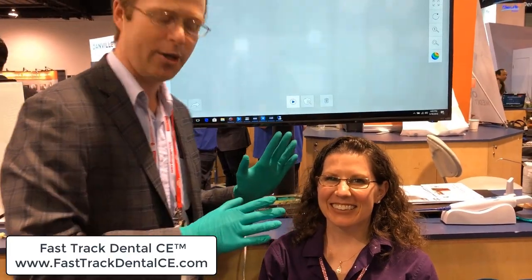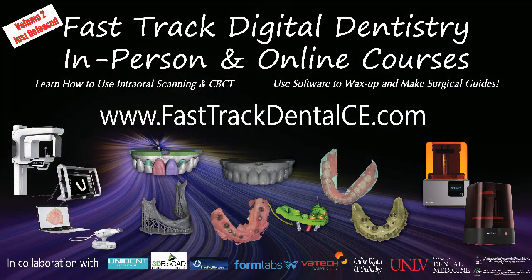I have my absolutely gorgeous, beautiful orthodontist wife, Dr. Melissa Chotel. She's no stranger to being scanned — I do live training courses at Fast Track Dental CE where we throw her in the chair for live scanning. We're going to put the scanner to the test. You saw the other video about the scanner — let's just go do a clinical demo.